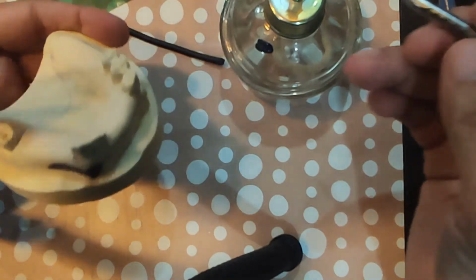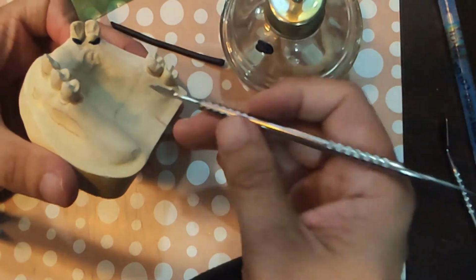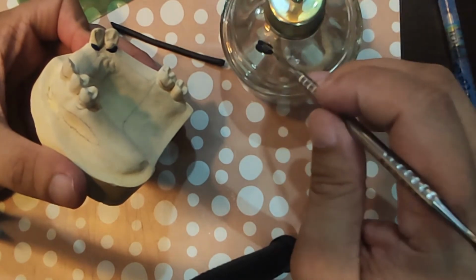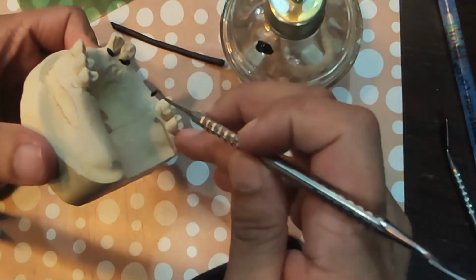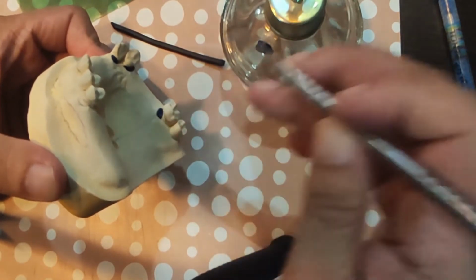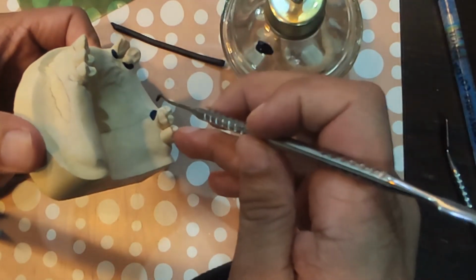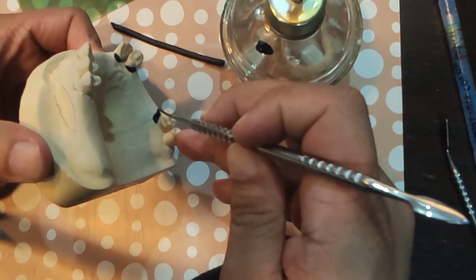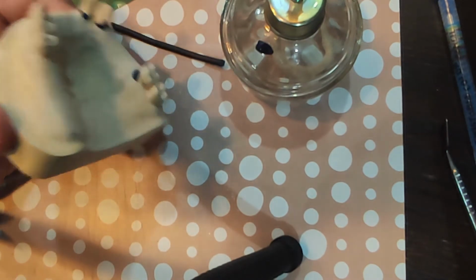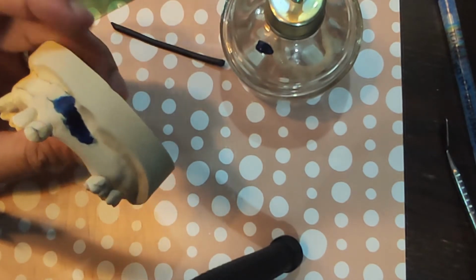There's a truss arm that's going to cross around this area here. So we need to block that out. Okay, so that is an example of your parallel blockout.